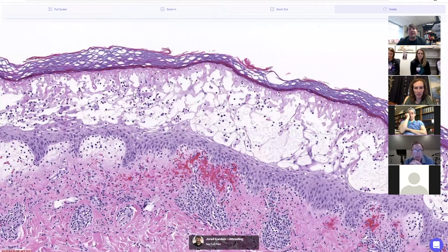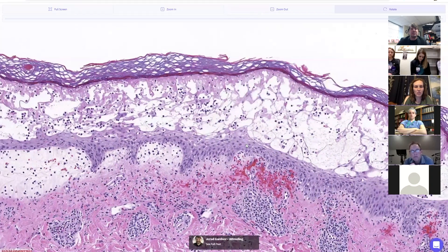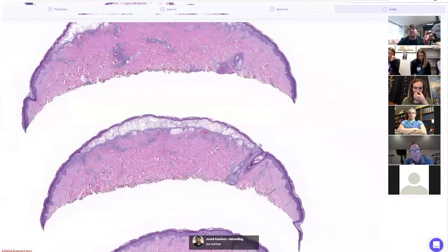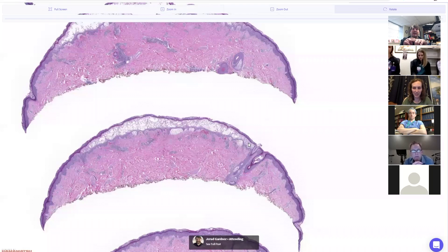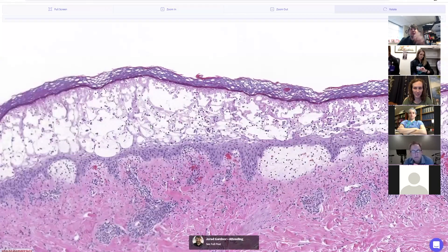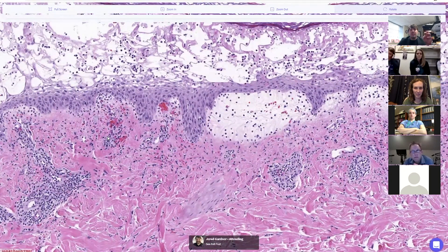All of these features point to hand, foot, and mouth disease caused by coxsackie virus. It's often recognized clinically, but sometimes it has an atypical presentation and gets biopsied. This is one of the most beautiful examples — you can see the perfect shape of the entire lesion and understand why it looks like a swollen, erythematous, pustular lesion clinically, swollen up with all this fluid.